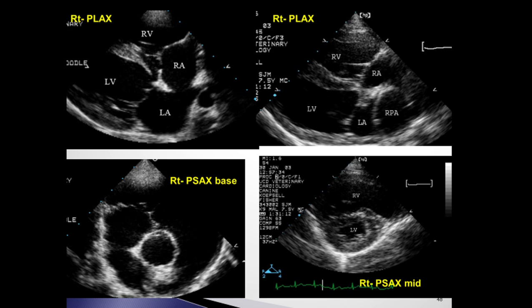Even though it's not mandatory in our transthoracic protocol, always do it, and you will be surprised that many times there is some pathology, especially aortic aneurysm at the ascending aorta, that we don't record in the standard PLAX view. We have to go a little off axis, slide our probe toward the midline to the aorta more, and maybe twist a little clockwise and see the ascending aorta.